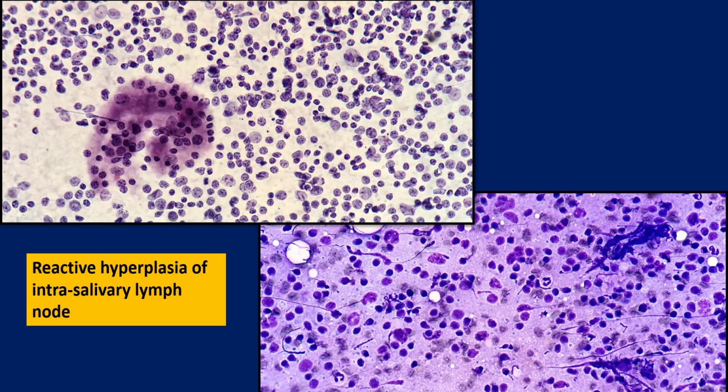So I'm going to show you representative pictures of each one of these lesions, because this is an approach lecture. We cannot go too much into details of each and every lesion. So it is more something which I would like to look at from a differential diagnostic point of view, as I had mentioned in the previous lecture.